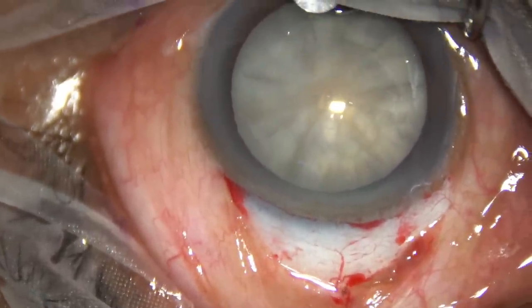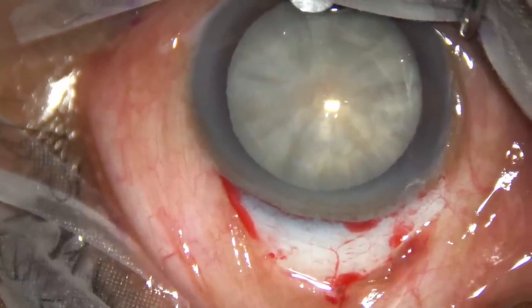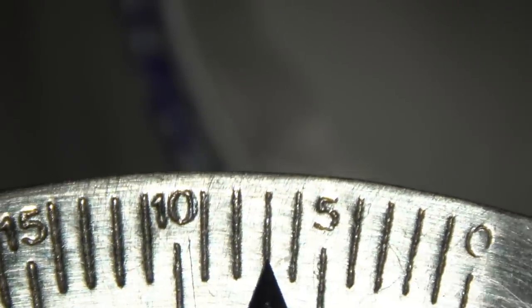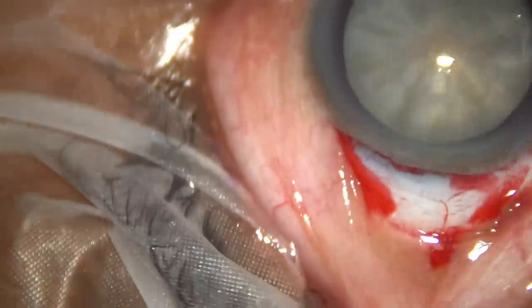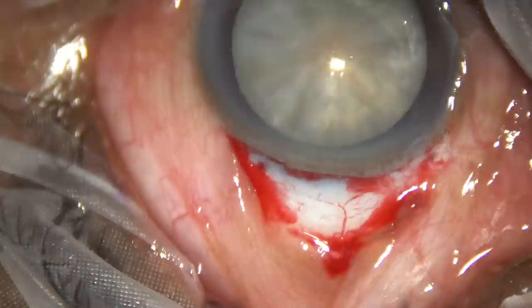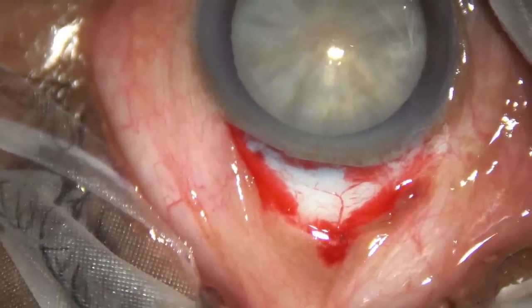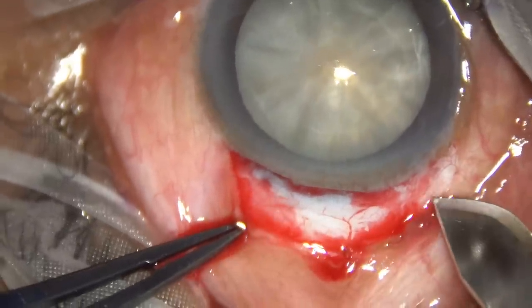This is a hard cataract, so we should make the wound size about 7 millimeters. This is 7 millimeters. This much. So we'll start from here and end here.